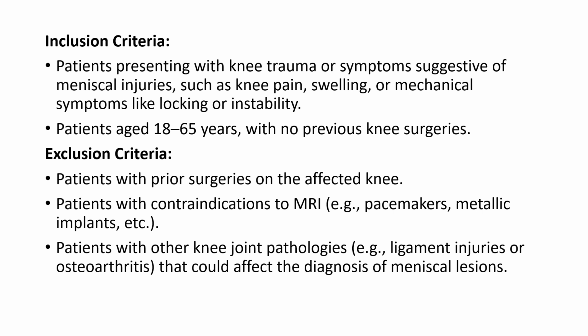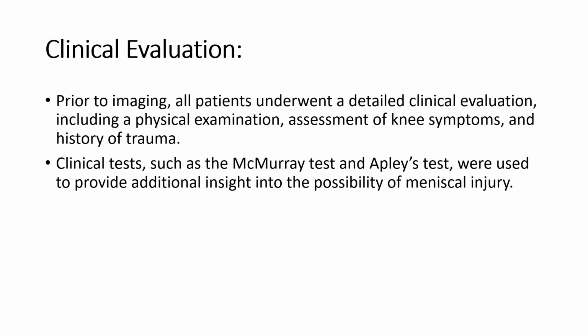Inclusion criteria included patients with knee trauma or symptoms suggestive of meniscal injuries, and patients aged 18 to 65 years with no previous knee surgeries. Exclusion criteria were patients with prior surgeries on the affected knee, patients with contraindications to MRI, or patients with other knee pathology which could affect the diagnosis of meniscal lesion. First, clinical examination was performed in all the patients, including physical examination, assessment of knee symptoms, and history of trauma, and clinical tests such as McMurray test and Apley's test were performed.